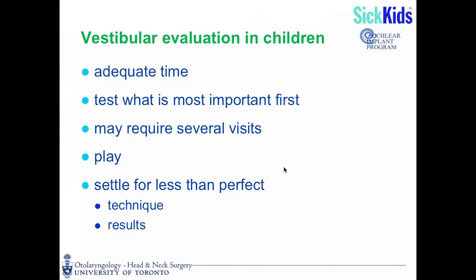I think you have to realize that it may require several visits, so depending on the day, the time of the nap, the mood the child woke up in that morning, what the other routine was for the day, it may require several visits, and simply having the same child back on a different day can make a world of difference between achieving results and not getting any useful information. You have to be ready to play and to have lots of accessories for play, and oftentimes an additional tester whose sole focus is to play with the child so that you can get done what you need to do.